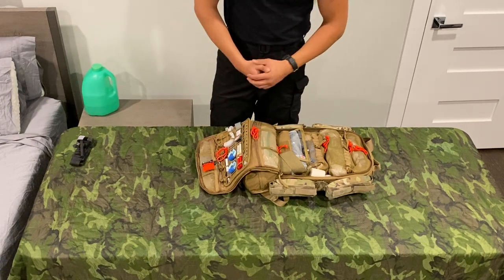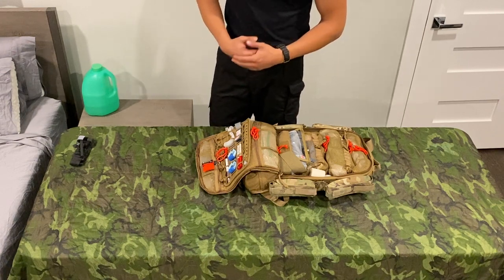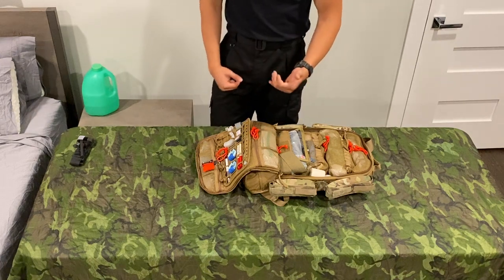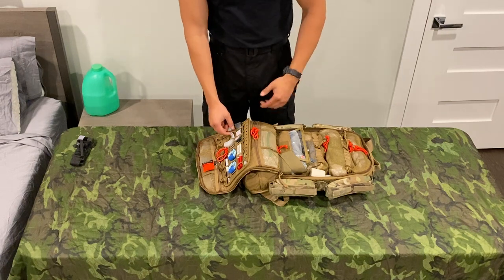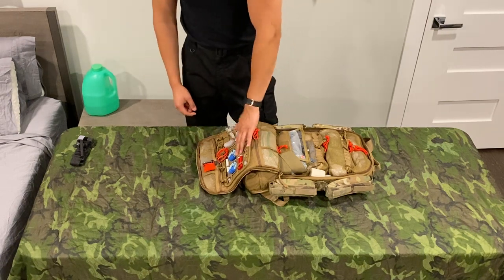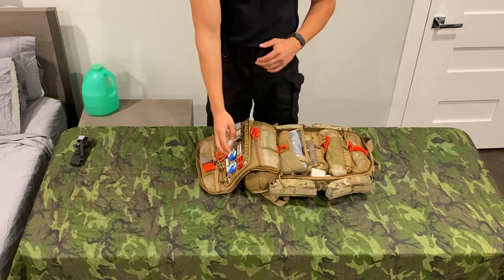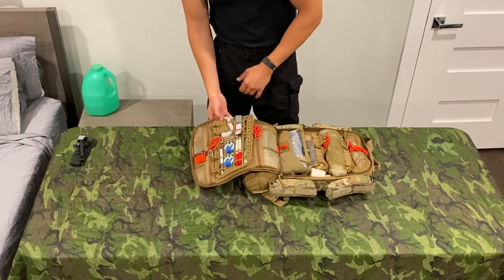14 gauge NCDs for tension pneumothorax or hemothorax. The 10 gauges are better for a hemothorax, so I am looking into getting some 10 gauge NCDs. The 14 gauges do work — definitely work for both. These aren't the ARS version; I have some ARS ones in other areas of my kit, but these different brand ones fit a little bit better in the instrument panel.